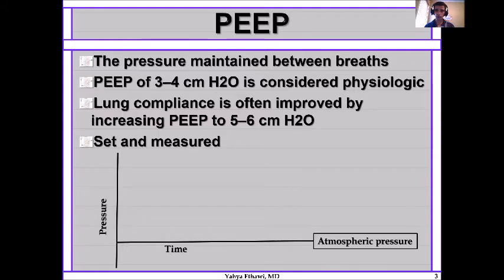Therefore, to move the air from outside the body to the lung, you need to increase that pressure. So PEEP is any pressure above the atmospheric pressure, because you need to keep the alveoli open. It's the same as CPAP, but CPAP is not invasive. CPAP is the applied pressure, but the resultant pressure, which is the PEEP, is the pressure needed to open the alveoli.